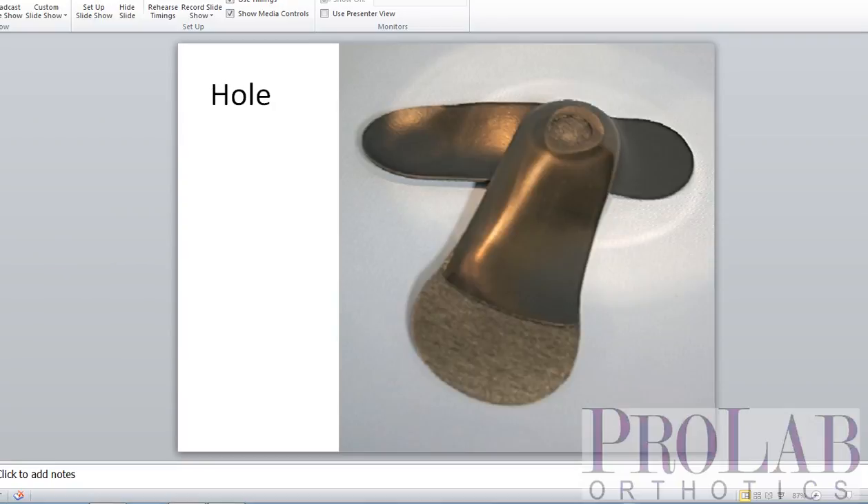The next is the hole, and this is just an extension of the spot grind where we grind all the way through. That does two things: it makes the spot grind itself wider so it's a little bit more stable, and second, it makes it thinner. We've gone all the way through the device so it sits lower inside the shoe.